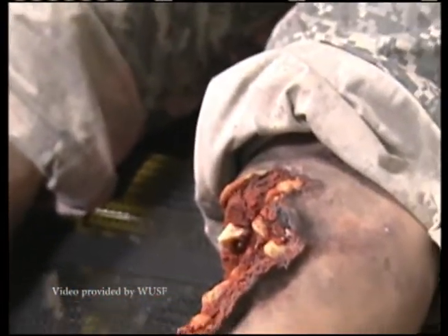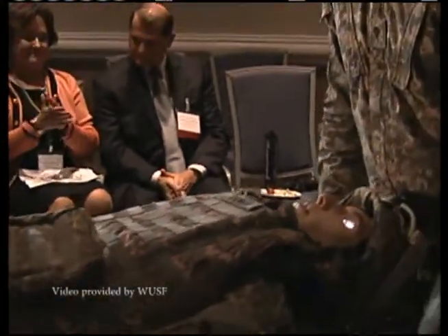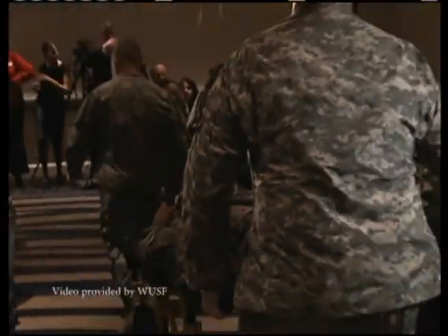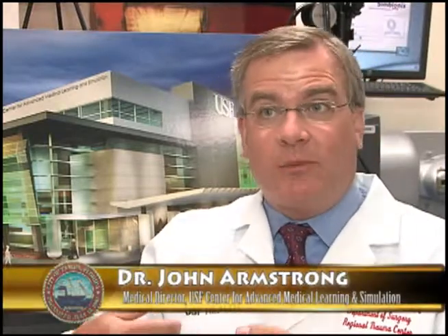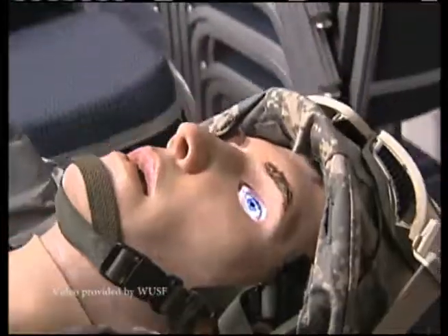The second thing that it demonstrates nicely is what's called tension pneumothorax. And a tension pneumothorax is air in the chest cavity outside of the lung that builds up pressure and restricts the ability of blood to get back to the heart. And if blood can't get back to the heart, blood can't be pumped out of the heart, needless to say, you lose blood pressure. This simulator replicates both of these scenarios to a very high degree.